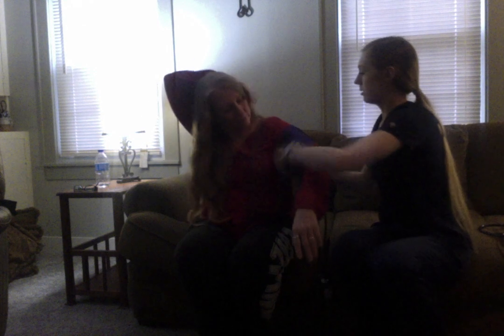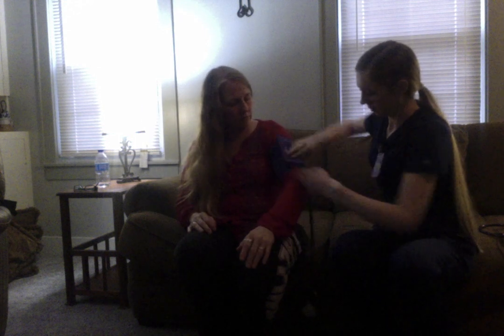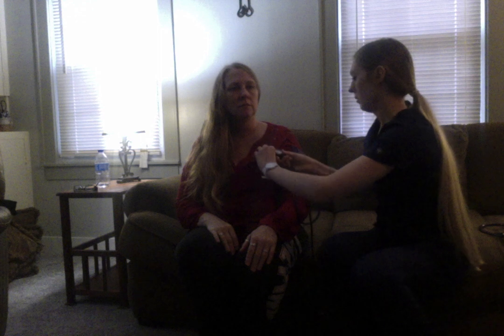First we'll do your blood pressure. We'll use your brachial artery for that. Patient's blood pressure is 124/72.